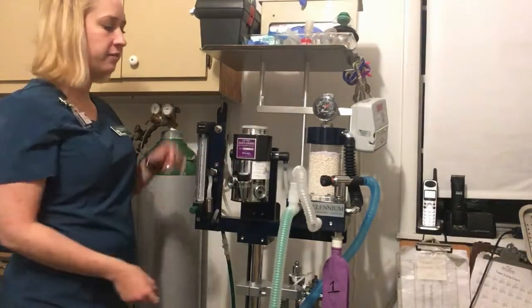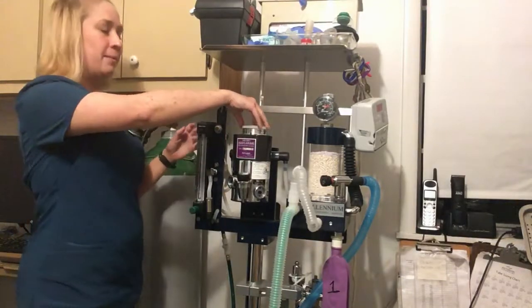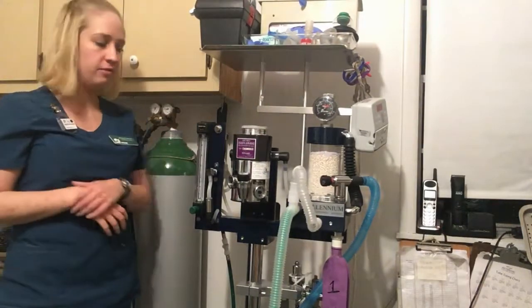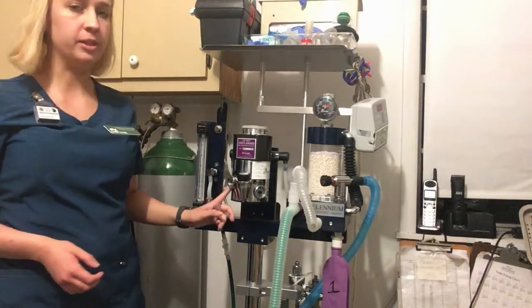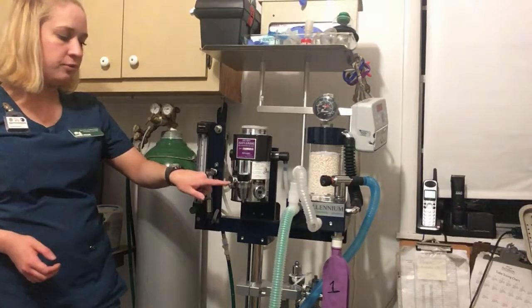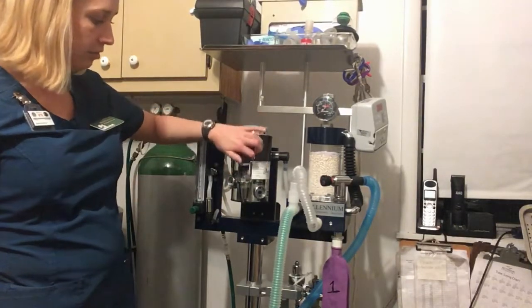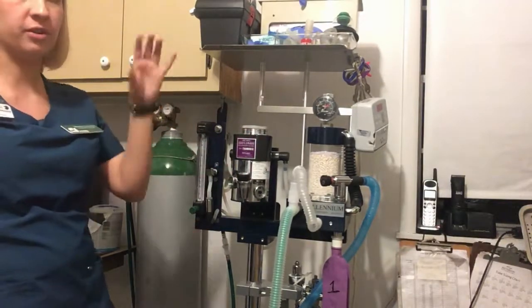So moving on, you go to the vaporizer. We have an isoflurane vaporizer here. When you turn it on, you'll push this black button on top, and then you'll turn the dial to increase and decrease the amount of isoflurane that is flowing through the system. This right here will show how much isoflurane is in the vaporizer for this system. You do want it full at the top of this black dot right here. This right here is where you'll open up and fill with your isoflurane. You don't want to have it open too long, or it will start vaporizing into the air.